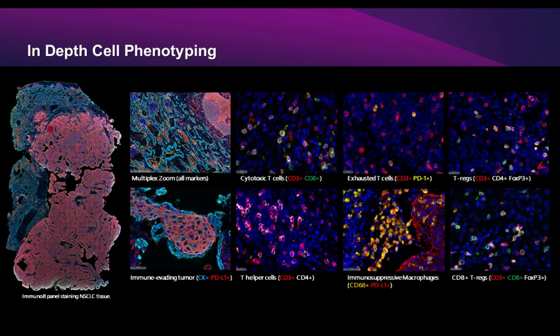As we had an earlier question about looking at the different cellular spaces, membrane, cytoplasm, nucleus, typically with cytochemistry or cell preps, those membranes can be easily disrupted, which can diminish membrane signal, to get into the nuclei and stain for nuclear signal. So it is a tricky balance, and there are multiple fixation strategies that can be applied to get the best of both worlds. But I can't speak specifically on the Ultivue InSituPlex for cytochemistry itself.